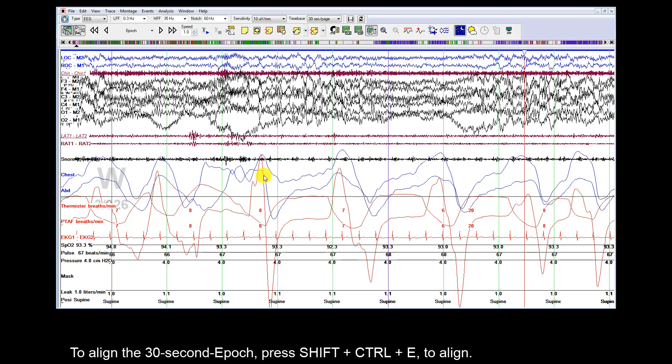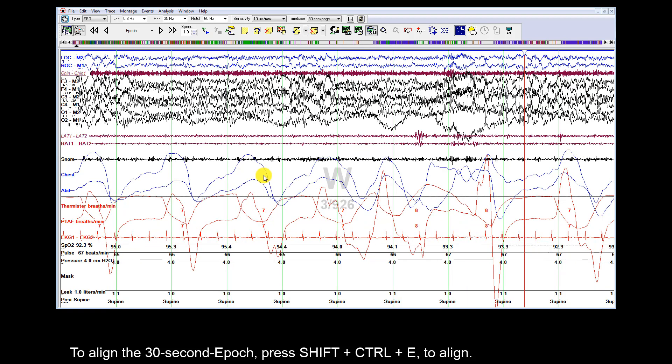To align the 30-second Epochs, press Shift, Ctrl and E to align.